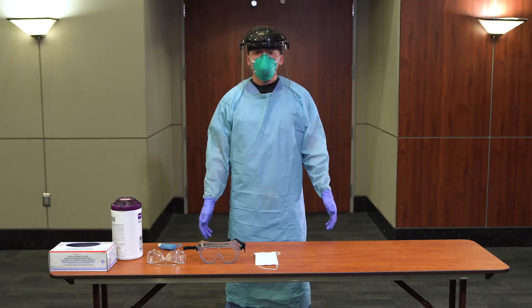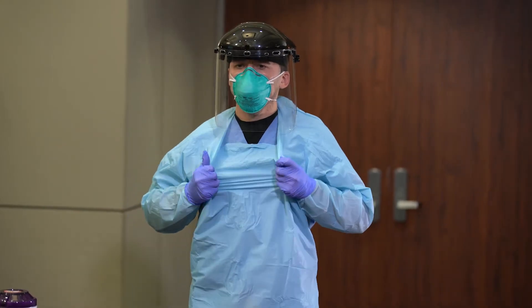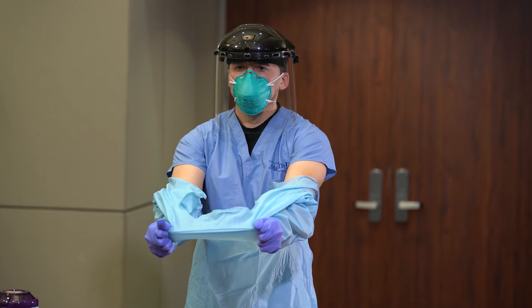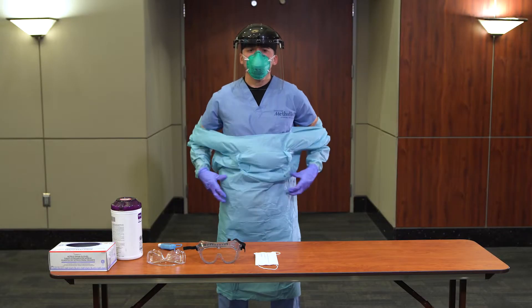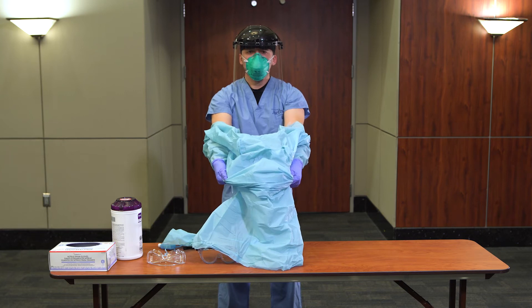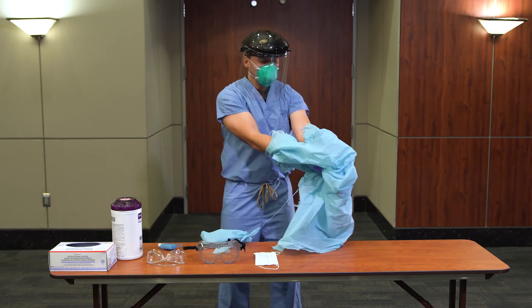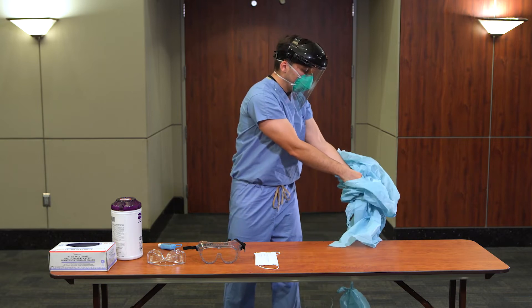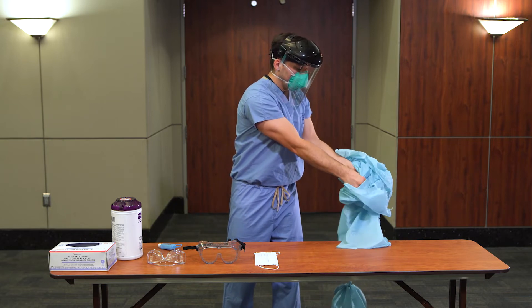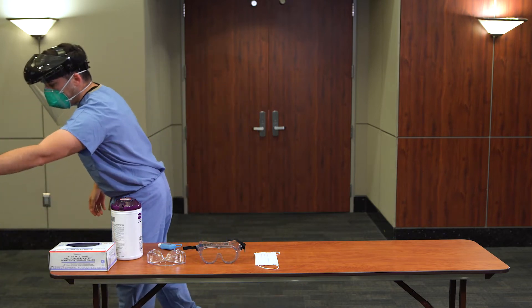Doff isolation gown and gloves by grabbing the isolation gown at the chest and pulling forward. Grab isolation gown at the waist and pull forward. As you are removing the gown, peel off your gloves at the same time, only touching the inside of the gloves and the inside of the gown with your bare hands. Place the gown and gloves into a waste container. Perform hand hygiene.